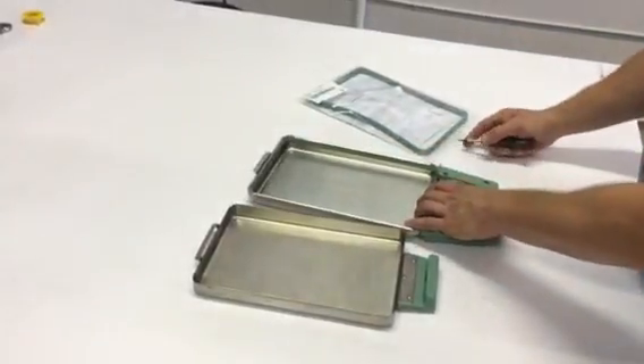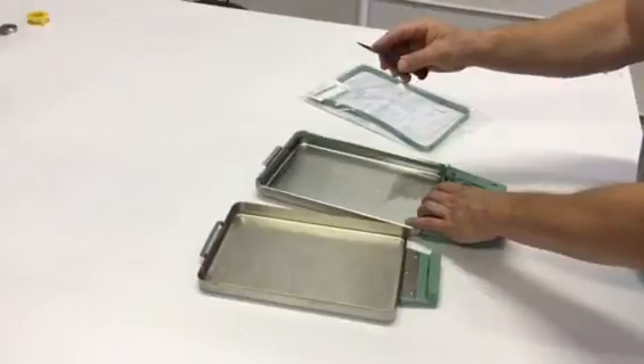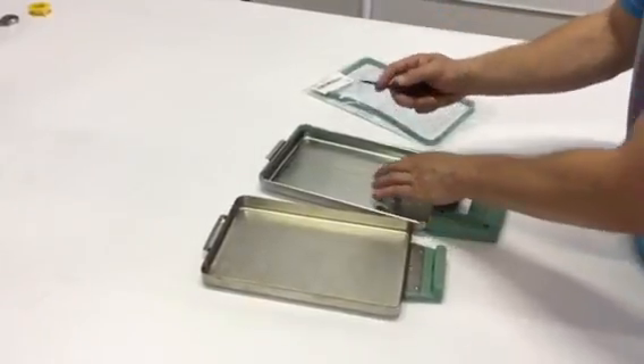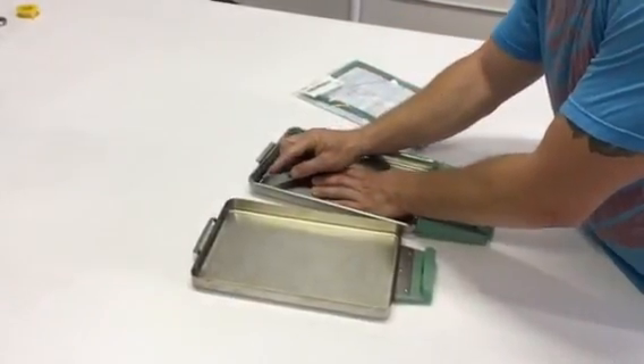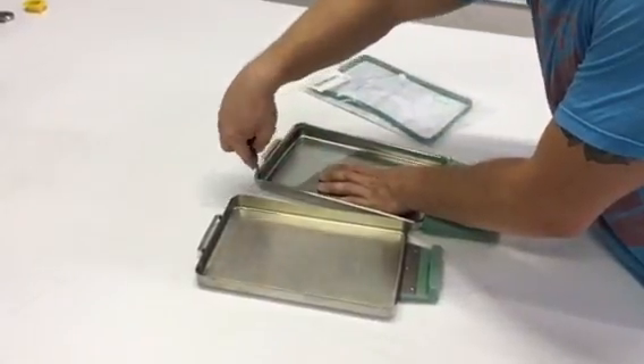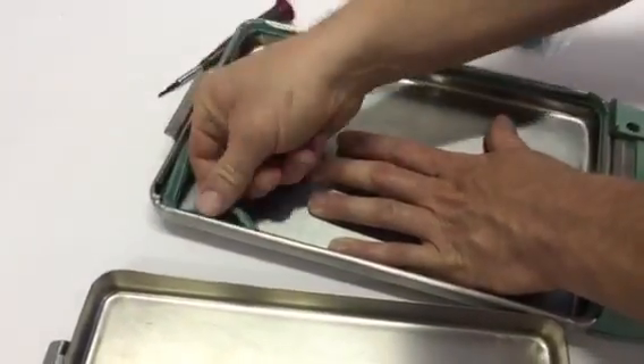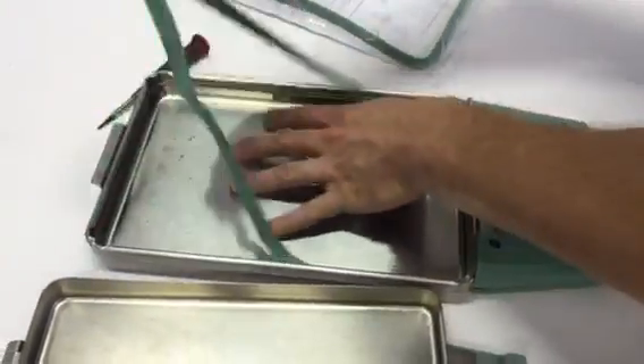It's real simple to uninstall the seal. You're going to want to use some sort of spatula or something to pry the seal out. You're just going to want to take the screwdriver and stick it into the metal and then kind of wedge it down, then pull it out, and from here you can kind of pull the rest of the seal out.